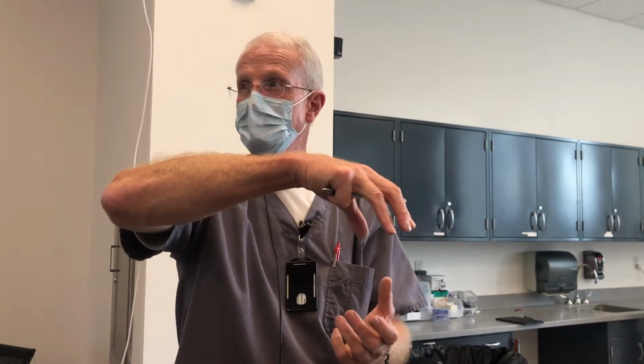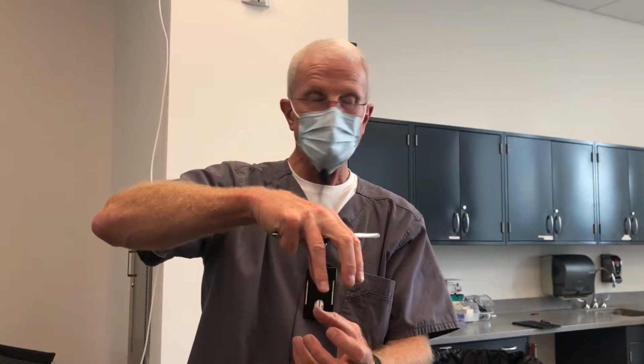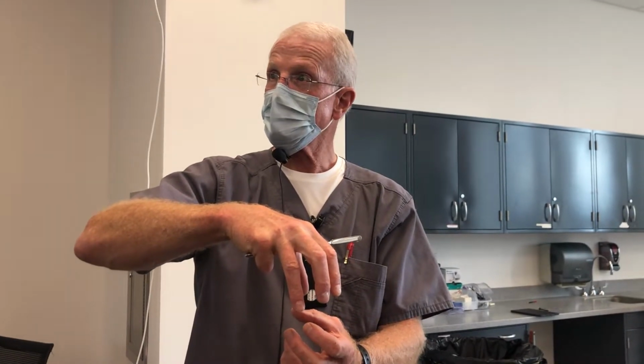But what can happen, especially with milled zirconia crowns where the internal aspect is not quite as accurate as a casting, like a cast gold crown or a PFM crown, they're better adapted. Milled crowns that are milled from the inside are a little wobbly sometimes. And so the cement really becomes an important component there, that it's got a good compressive strength, and that it is not very soluble, okay? But what can happen is it can actually move a little bit. It'll shift when they bite down on it.